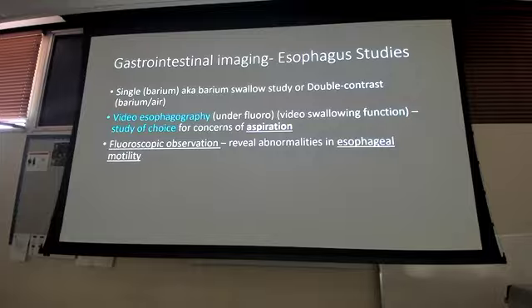A barium swallow is where the patient swallows the liquid barium while we're just taking regular x-rays to look at the structure of the esophagus, to look for things like ulcers or diverticula. The video esophagography is for somebody who's aspirating, and they still sometimes call it a swallow study in the clinic. But now you're using fluoroscopy and watching them swallow. You watch the liquid barium, watch the epiglottis come down, watch the stuff go into the esophagus, and make sure none goes in the trachea.